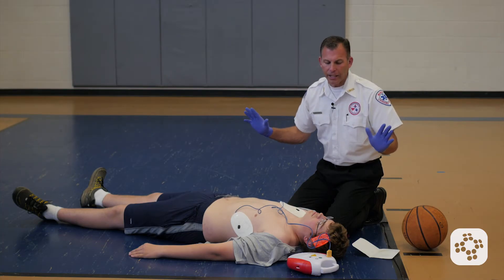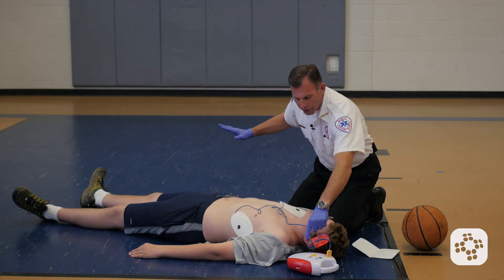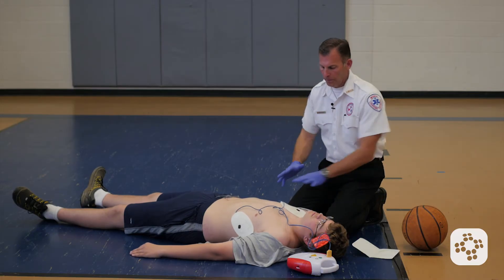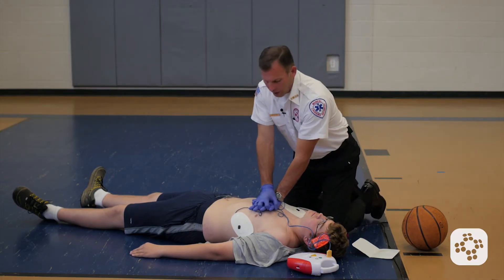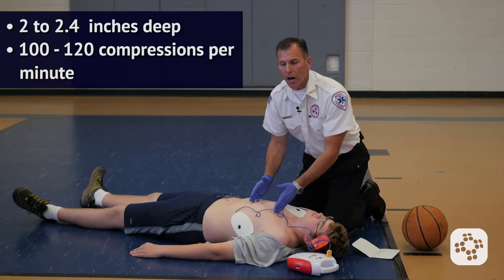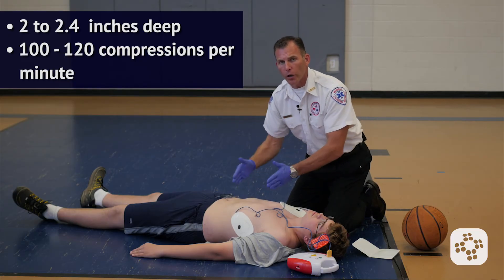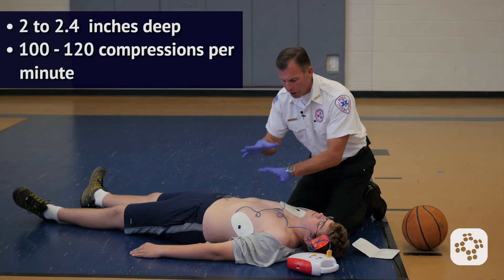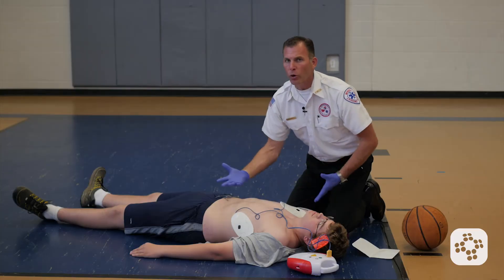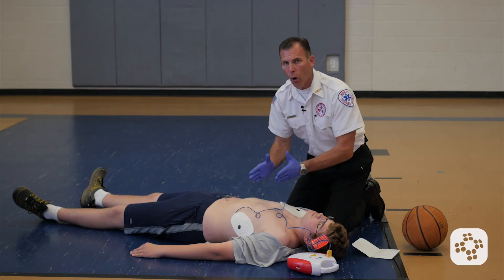We allow the AED to charge. Everyone stand clear — push the shock button. Nobody's touching the patient. I discharge. Shock delivered. Begin five cycles of CPR. It's important that we go straight into chest compressions — the same way we did CPR, that 2 to 2.4 inch depth, 100 to 120 compressions per minute. We go right over the cable and right over the AED pads. We don't remove them, we don't disconnect them — we just do our compressions right over them.